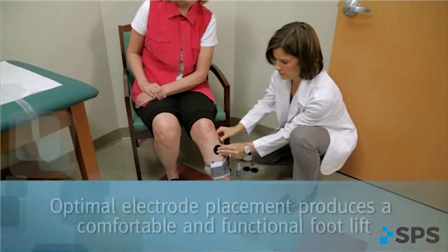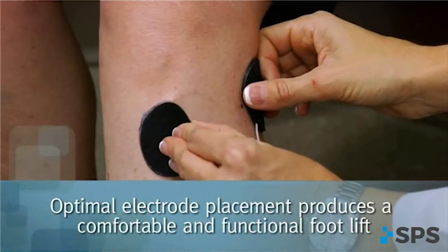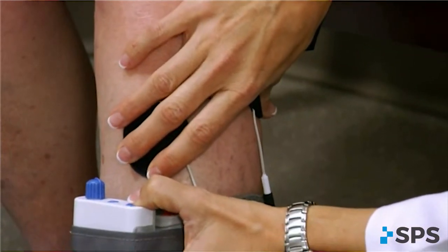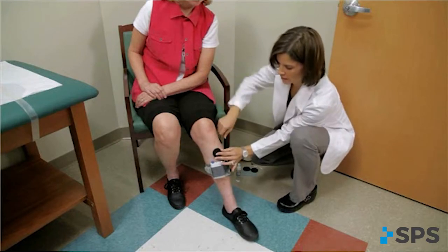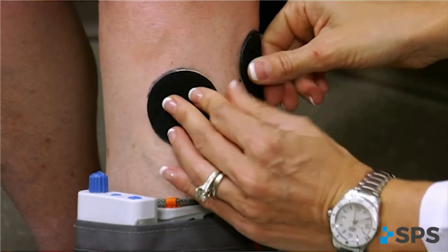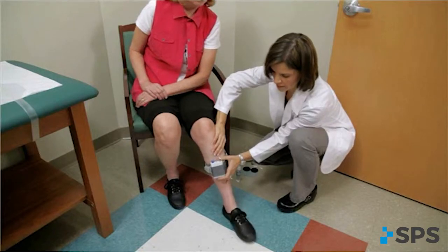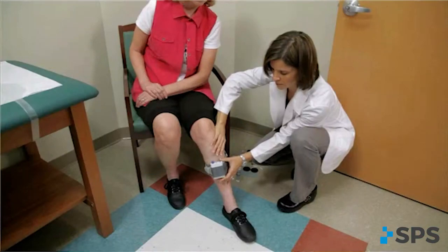Another way to affect the response to stimulation is to move the front electrode farther away from the back electrode. Separating the two electrodes drives the stimulation deeper towards the deep peroneal nerve, which will encourage dorsiflexion. Moving the electrodes closer together produces a more shallow stimulation, potentially stimulating the superficial peroneal nerve, which will encourage eversion. Know why you are moving each electrode and move them in a direction with purpose.